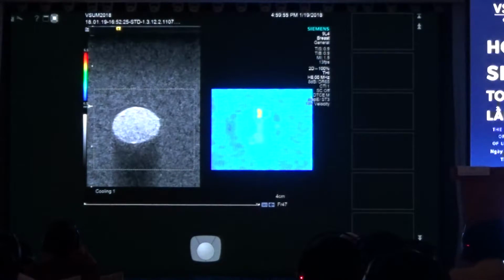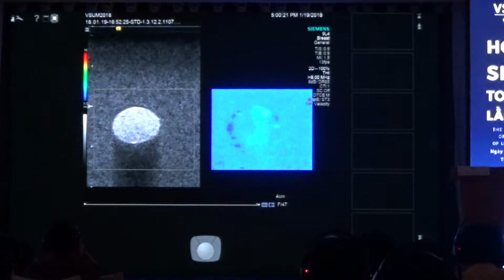What we can do is, one of the buttons on the bottom here, the fourth one from the left, says velocity. So this is giving us a plot based on the velocity, from 0.5 to 6.5 meters per second. Now, in breast cancers, we've had cancers that are above 10 meters per second. So there is a maximum velocity button, which is the third button, that we can use to increase the scale up to 10. On this system, 10 is the maximum we can go. If the value is higher than that, it'll say high, meaning it's greater than 10 meters per second.